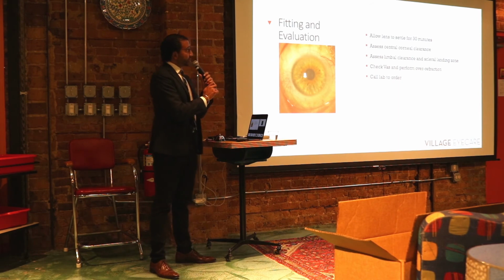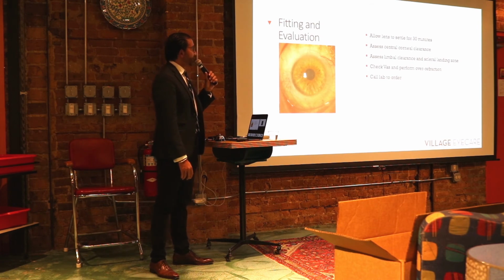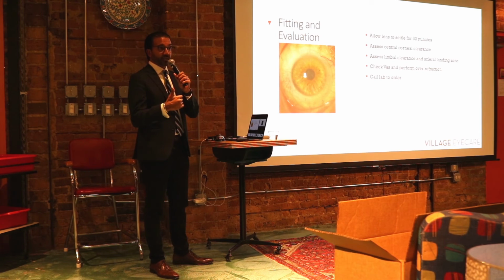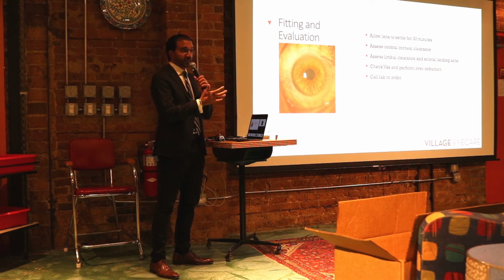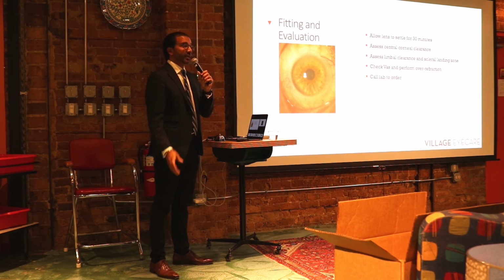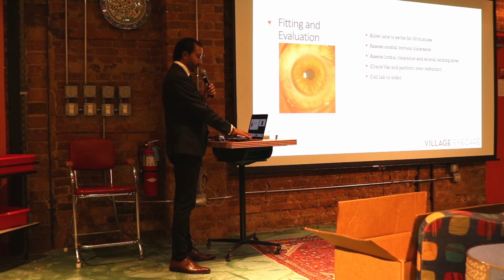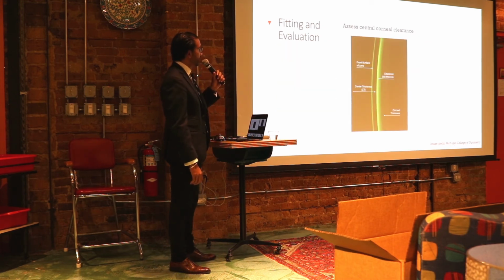So once the lens is on successfully, again, these diagnostic lenses may or may not have power depending on the fitting set that you have. You'll allow the lens to settle for 30 minutes, and after that time, our technicians will take a number of measurements. Once the measurements are taken, we will assess the scleral lens on the eye and do an over refraction and check the VAs. After that's done, we'll have all the information we need to call the lab to order the initial lens.